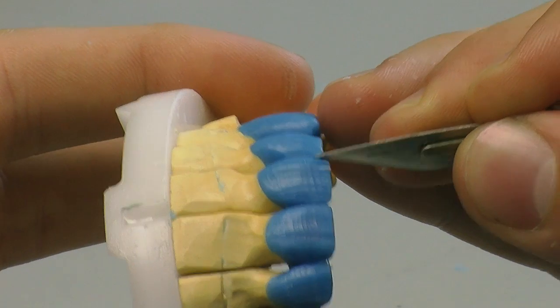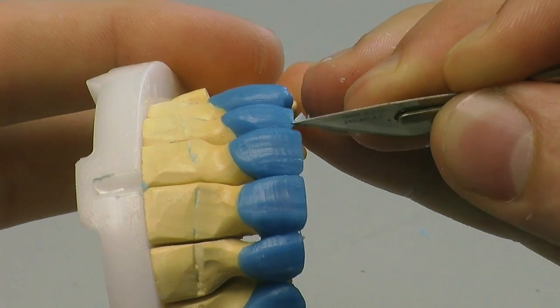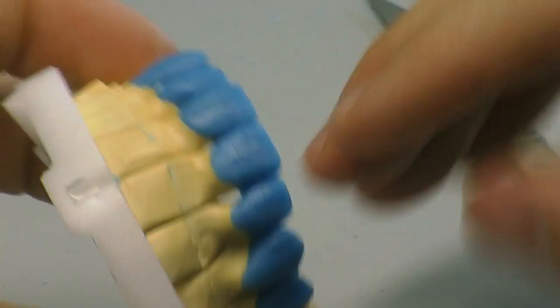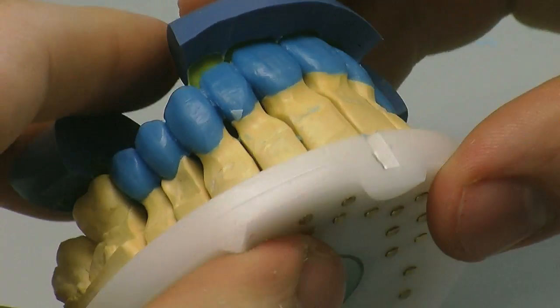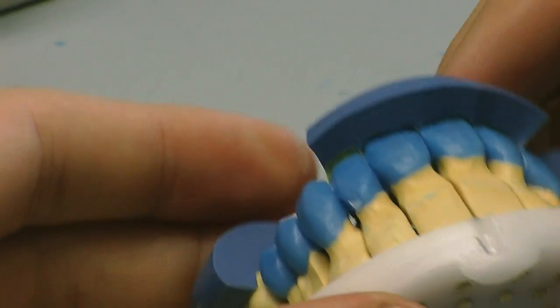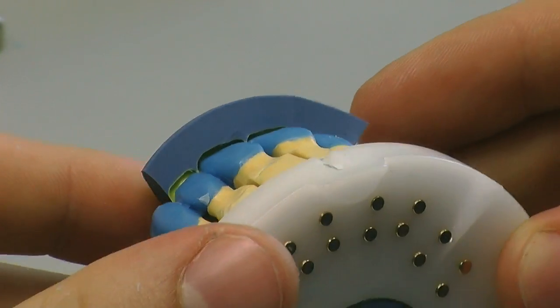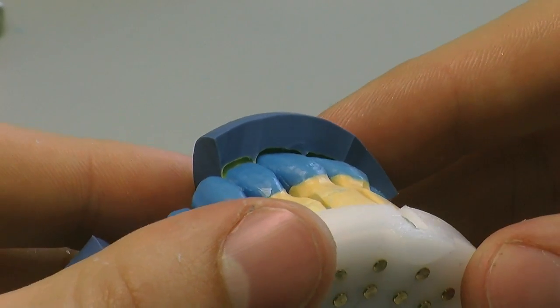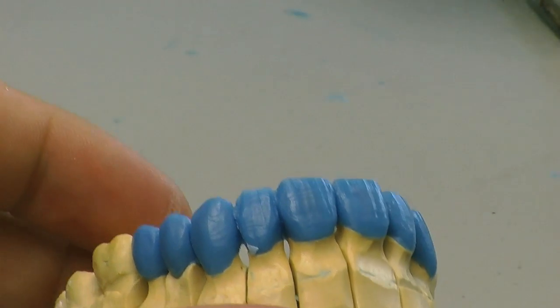So we're just finishing off the incisal cutback now, and we're going to be verifying that with the putty for the final time any moment now. We just need to make sure that we've got enough room for the ceramic porcelain, which we're going to be layering over the whole labial surface of these. And there, it looks fantastic. So about 0.5. It can be anything from 0.5 up to a millimetre.